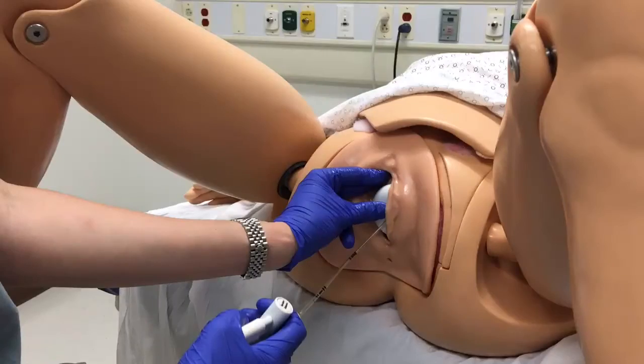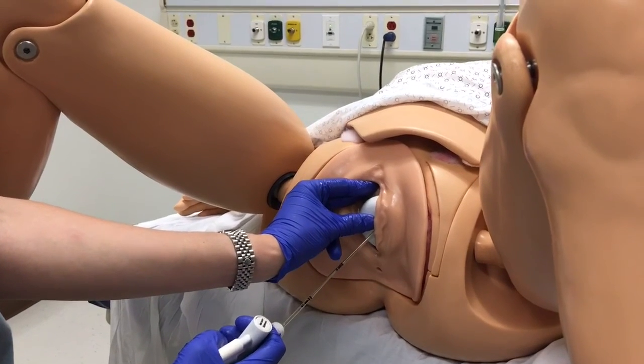The non-dominant hand will be placed in the vagina with your thumb on the cup and the other fingers on the head. Keep your non-dominant hand in this position while pulling. This will allow you to feel if the cup is starting to separate and allow you to feel the descent of the head. You will pull as mom pushes for the greatest benefit.